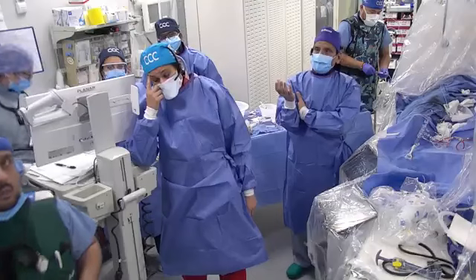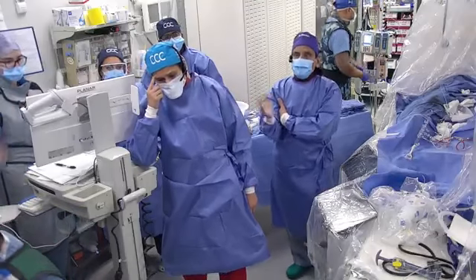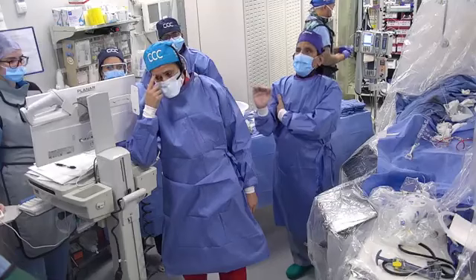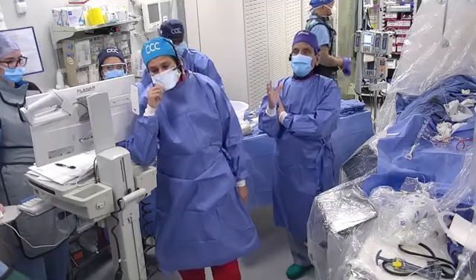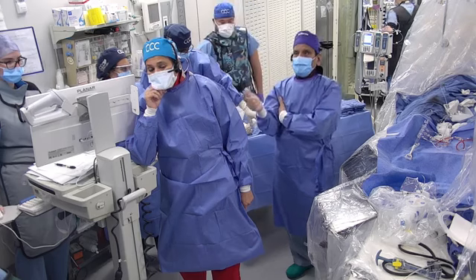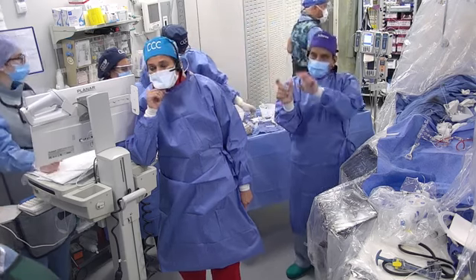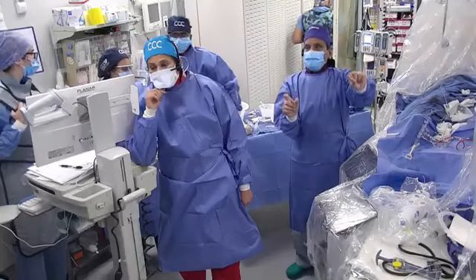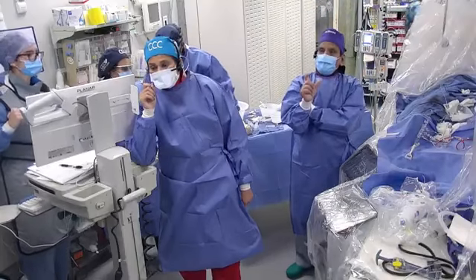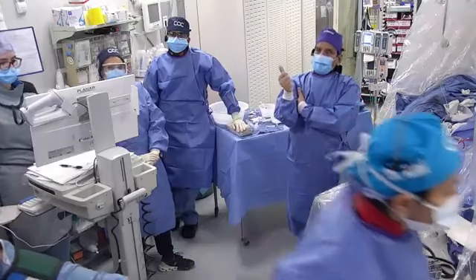We published 1200 patients, comparing about 950 rota with 250 orbital. We saw no difference in the slow flow. We found more dissection and more perforation in the orbital compared to rota, the same thing they saw in the Eclipse trial. Although Eclipse showed higher orbital atherectomy slow flow, our comparison was RA versus OA, and we found more dissection with OA and slightly higher perforation.